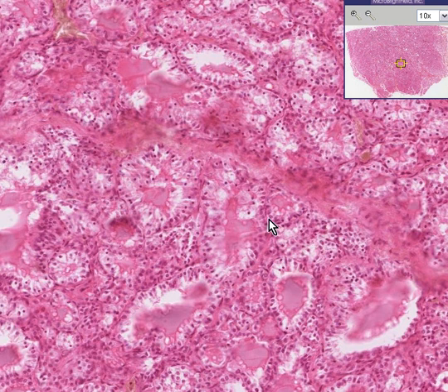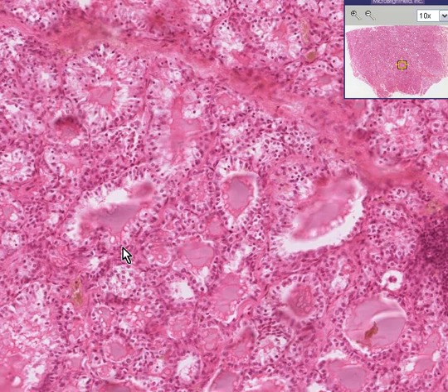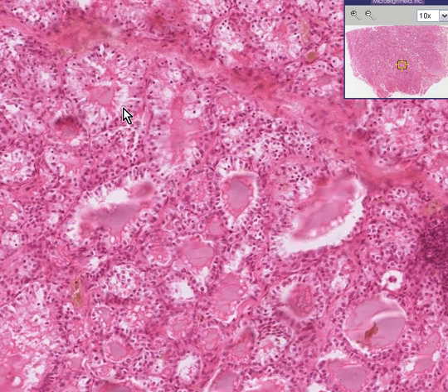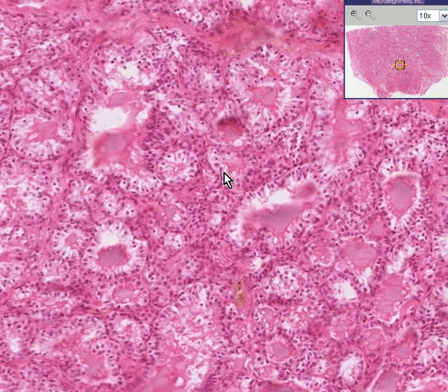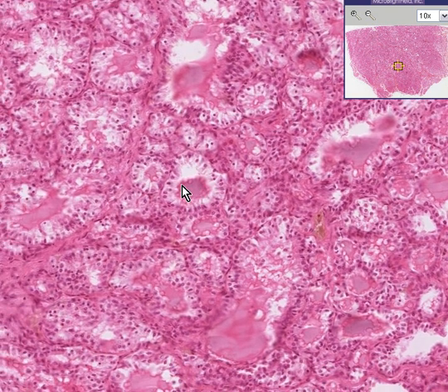I want to point out something — a concept that is one of the consistent findings in hyperthyroidism. If you notice, the colloid substance itself seems to have little open spaces along its edge, kind of like a scalloping effect. This is called scalloping, and it is very commonly seen in hyperthyroidism. Notice the colloid is not nice and round — it has jagged or scalloped edges.